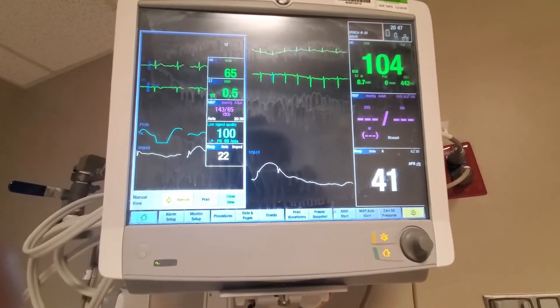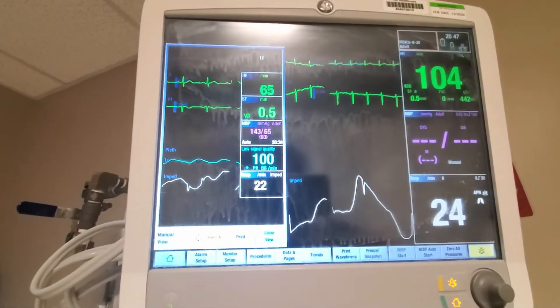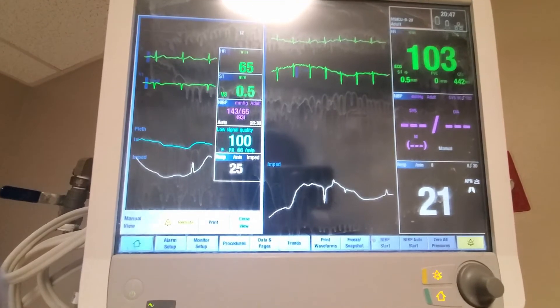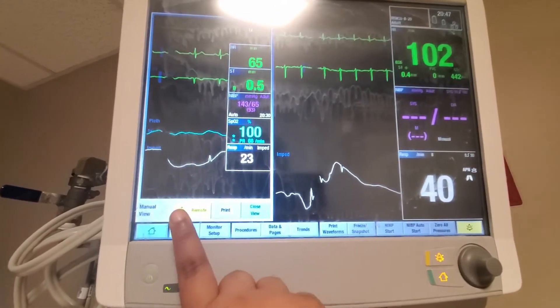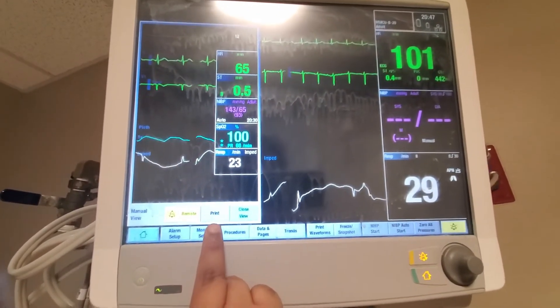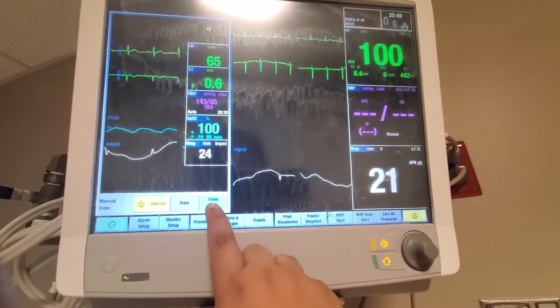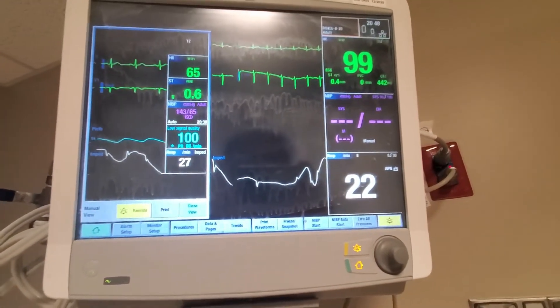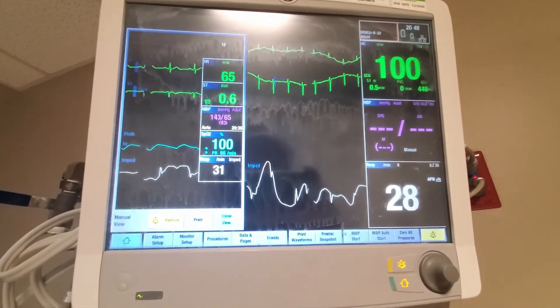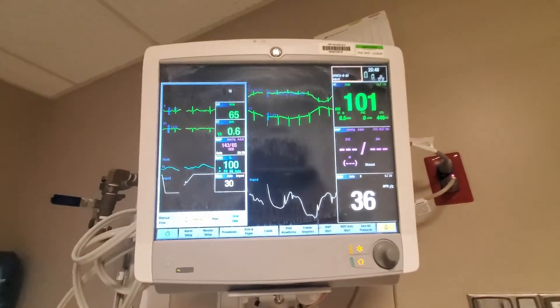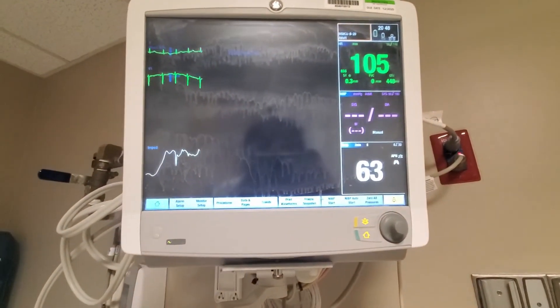Select the person and press view. Now on your screen you'll still be able to see what your patient is doing, but you'll also see what's happening in the other room. It will only show the room number — not the patient's name. While you're here you can remote silence, print your screen, and close the view. You can keep this up all day or for whatever period of time you want, and to get rid of it just press closed view.